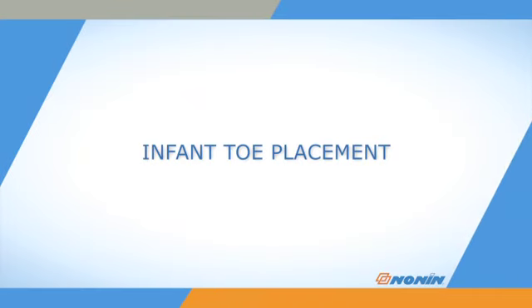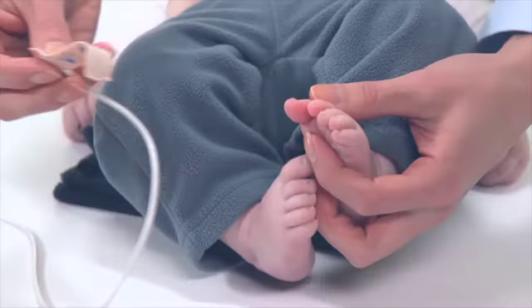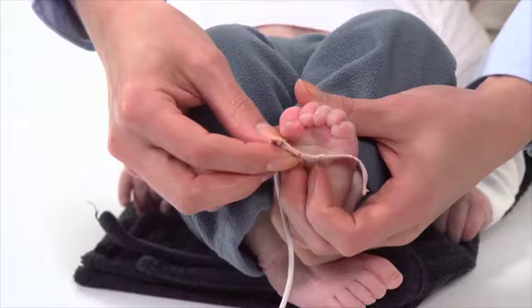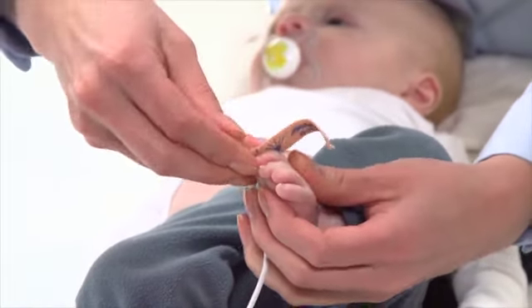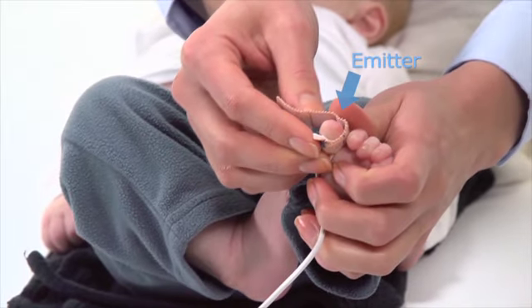For placement on the large toe of an infant over 4 pounds in weight, place the adhesive and detector portion on the bottom center of the toe, with the cable running back toward the heel. Now, wrap the sensor on top of the toe, placing the emitter on the top of the toe, across from the detector on the bottom of the toe.